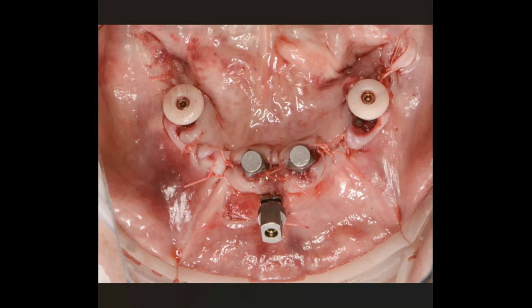And I've been doing this for years and years and years. I just thought everybody would be doing it. I've been doing it for years, talking about it for years, 3 years, 4 years. And I learned that people still don't do it. Just in my last digital workflow class in March, I was talking about this with Dr. Keith Klaus, and there was a doctor, a delegate, a practitioner in the class, and he said that he had just come from another class a few months ago, and they said, never put the fiducial in the midline because you can get a life-threatening bleeding risk.